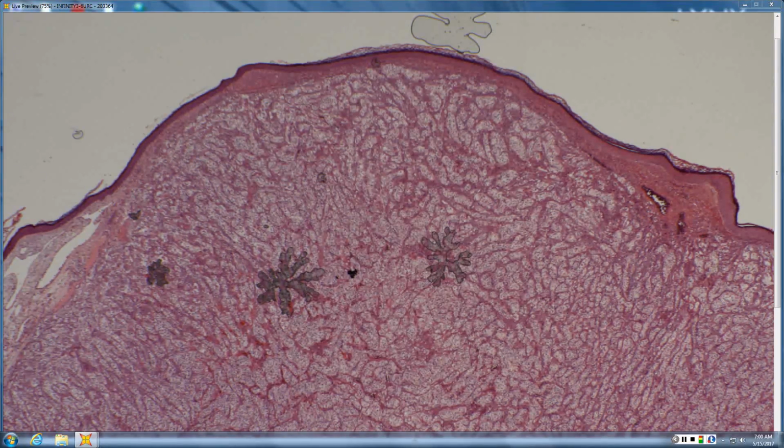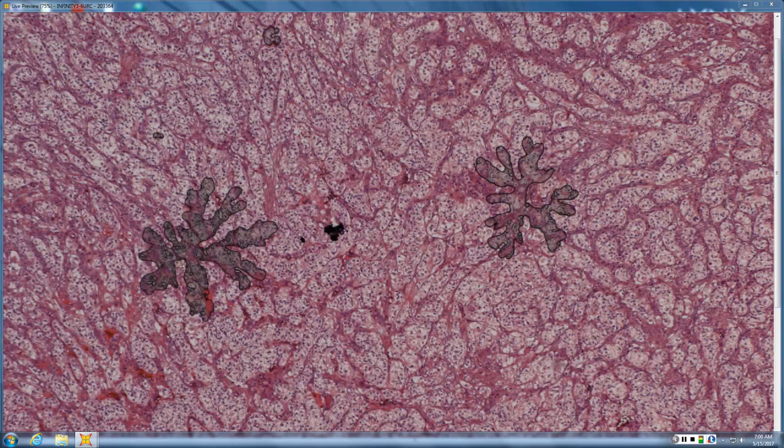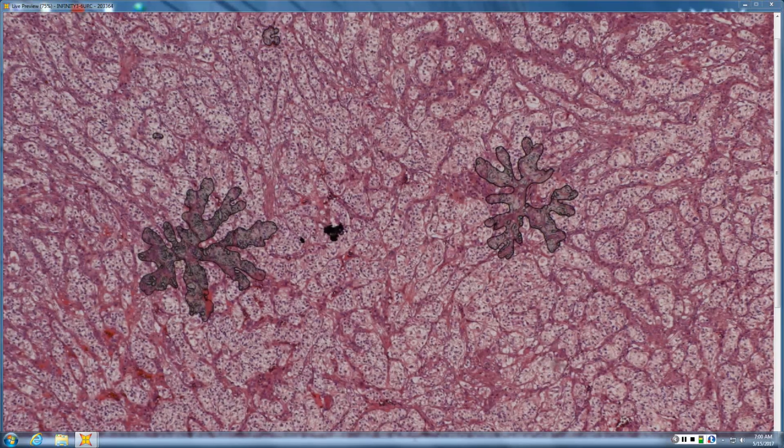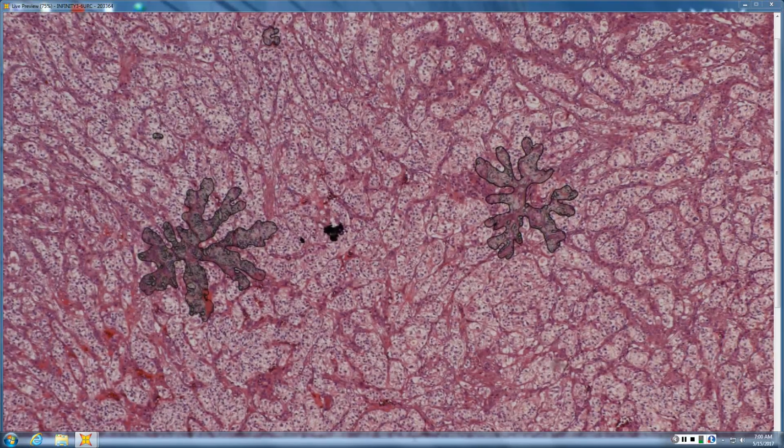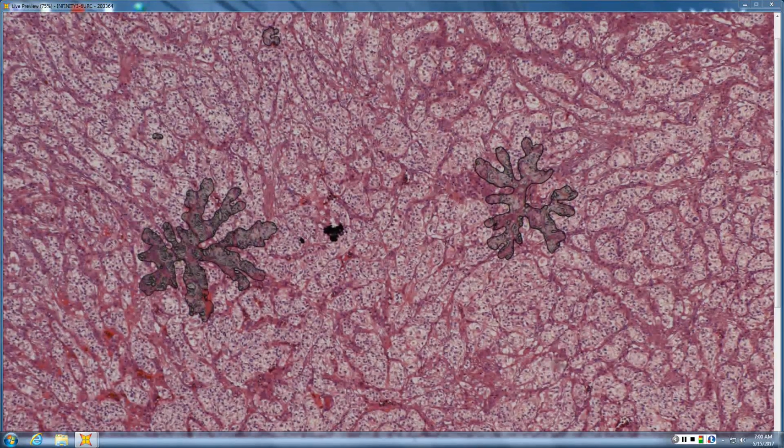It's commonly metastasized to the scalp, and you just get these plaques of clear cells, and can look very much almost like a little nest pattern. Usually has this sort of arborizing stroma. It's RCC positive and CD10 positive, and sometimes it's deceptively bland.